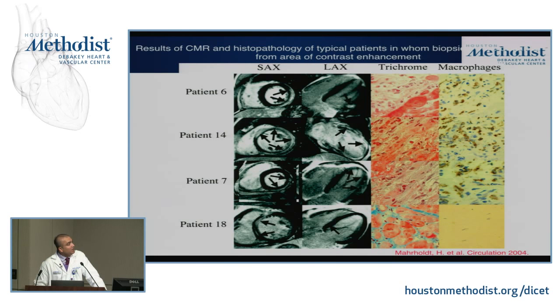Now, let me move on to another condition, myocarditis. This is a common referral that we'll see in the CMR lab. And again, I like to highlight this publication. This is almost 13 years old now, from 2004.